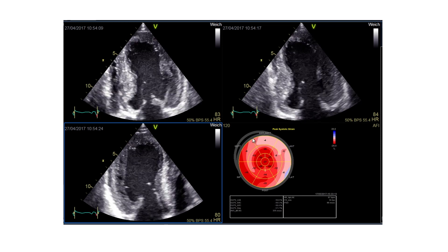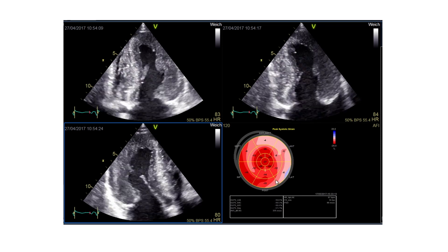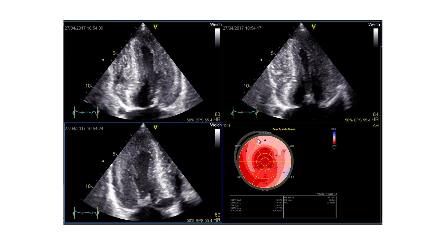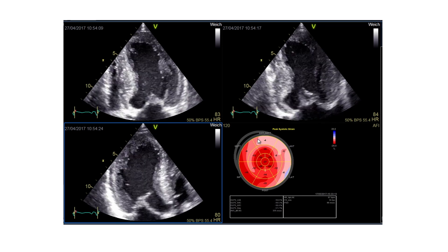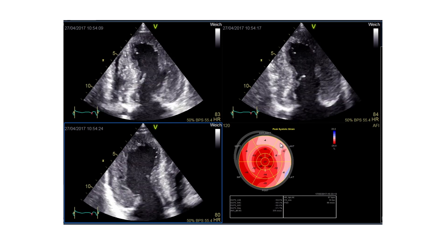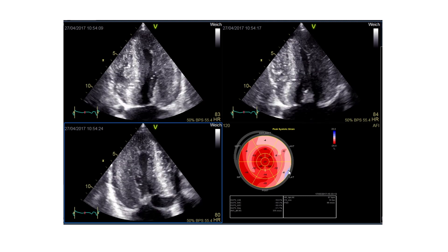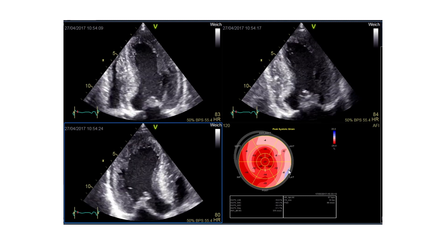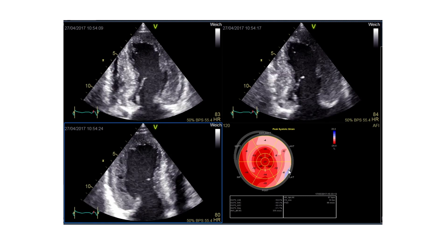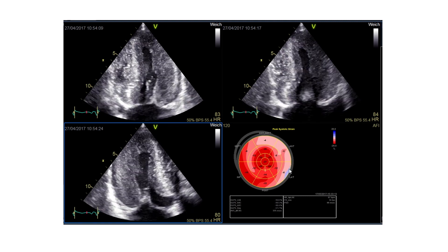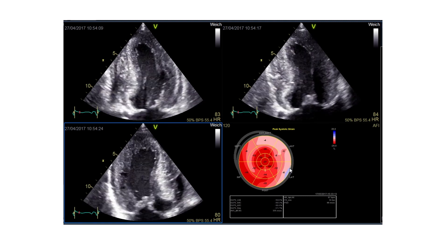Maybe we can go to the global strain, to the bullseye display, to again see the values and see which segments have the most problem. So in this bullseye analysis, we can see that the anteroseptal part and the anterior part, especially the basal segments of the left ventricle, are impaired in this patient.